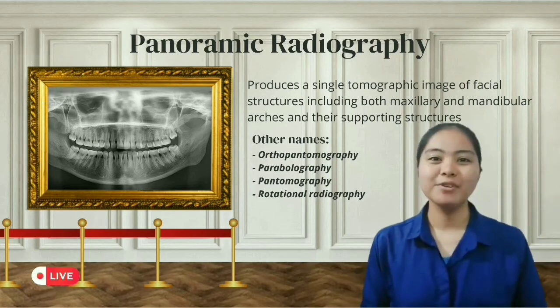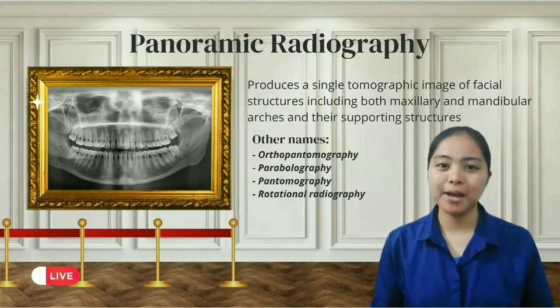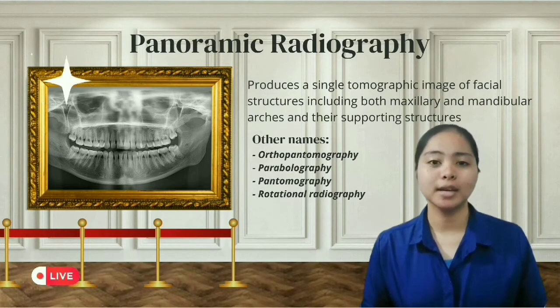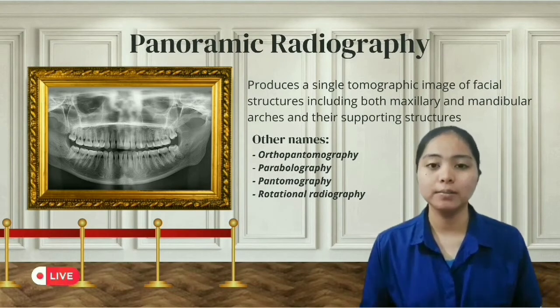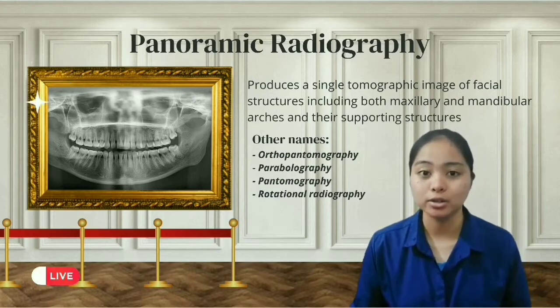Good day. I am your first tour guide for today, and we are now at the very beginning of the Panoramic Radiography Gallery. Panoramic radiography is a radiographic procedure that produces a single tomographic image of facial structures, including both the maxillary and the mandibular arches and their supporting structures.